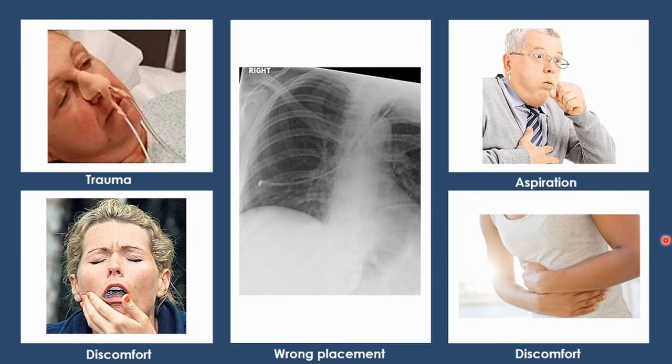Ano pang iba? Trauma. The tube can injure the tissue inside the sinuses, throat, esophagus, or stomach if not properly inserted. You're going to insert that into the patient's body. Absolutely, you're going to introduce trauma to the mucosal lining, okay? So just be aware about that.